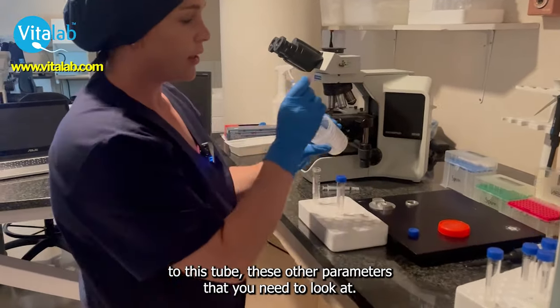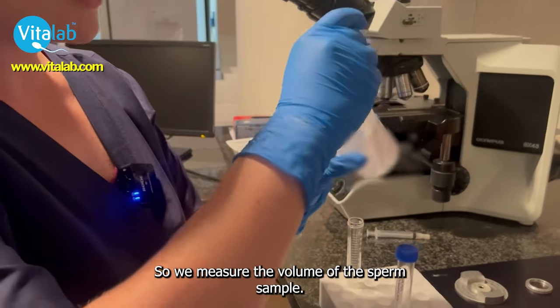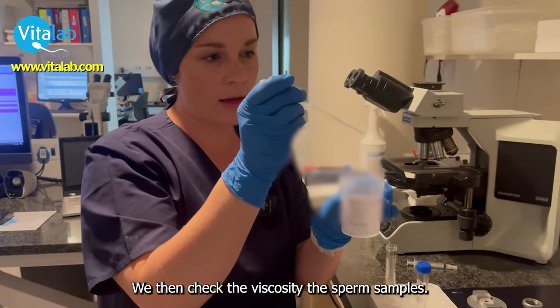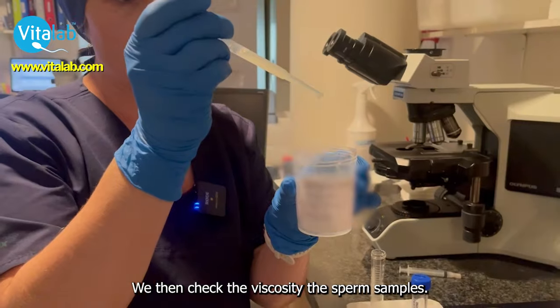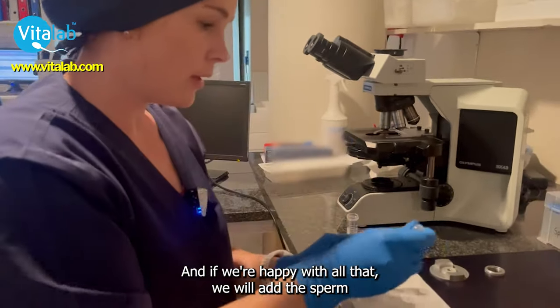Before we add it to the tube, there are other parameters that we need to look at. We measure the volume of the sperm sample, and we then check the viscosity of the sperm sample. If we're happy with all that, we will add the sperm to the gradient.